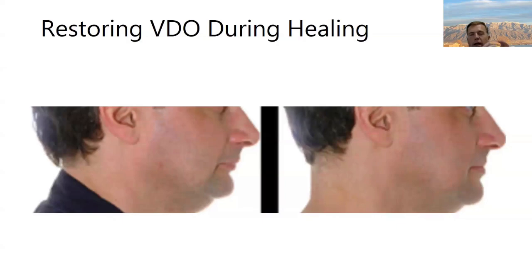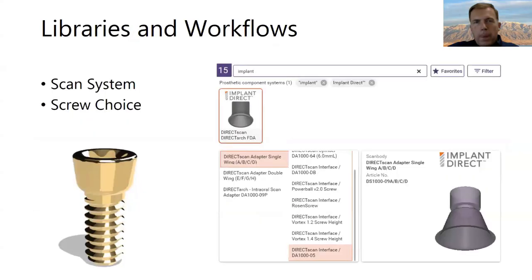So this is going to be a great time for the person to get used to it, and at the same time for us to use that prototype to evaluate everything and know that when we get to the definitive restoration, we're going to get a good result. I feel like you want to do big changes on the provisional, and then when you get to the prototype, make smaller changes, and then we want to make sure that the definitive restoration is the same as the prototype.